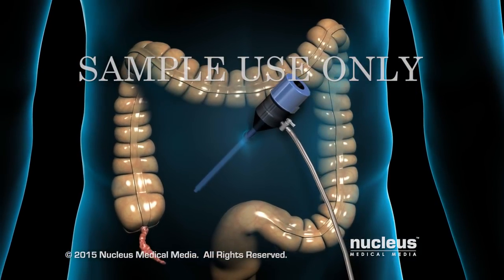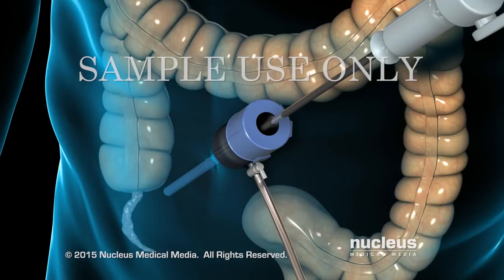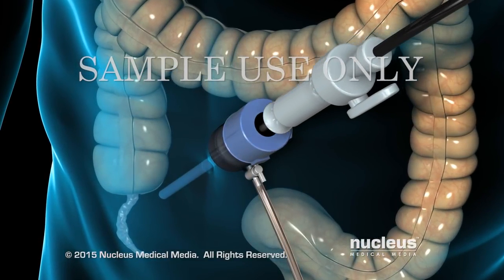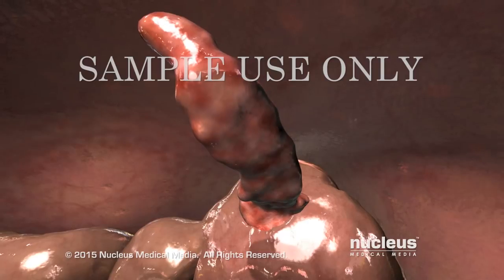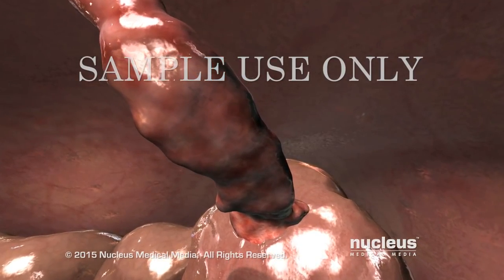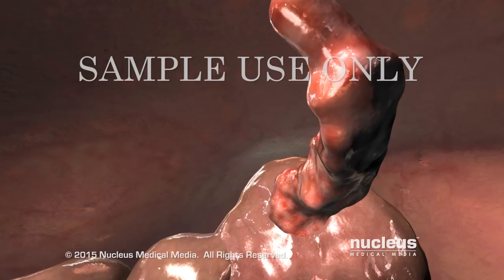Gas will then be pumped through this port to puff up your abdomen so its contents can be viewed more easily. Next, your surgeon will insert a laparoscope through this port. The laparoscope is a thin tube with a tiny camera on the end of it that projects images onto a monitor to guide your surgeon's work. Using the laparoscope, your surgeon will examine images of your appendix on the monitor to confirm that it's red and swollen.